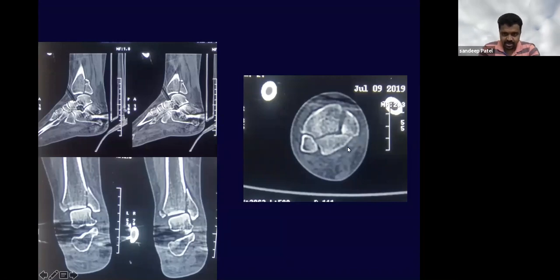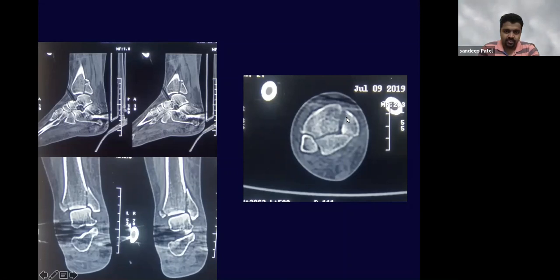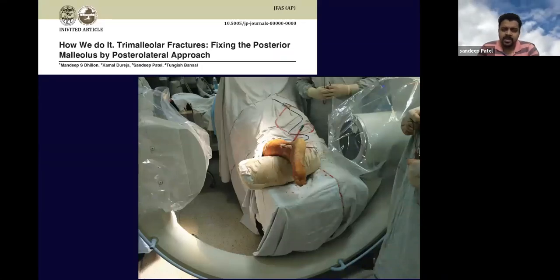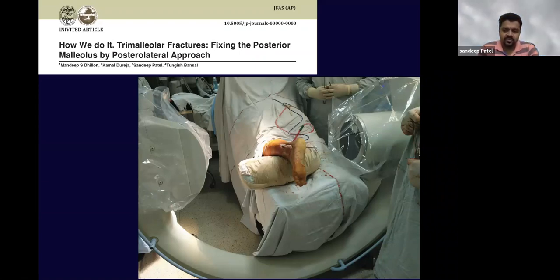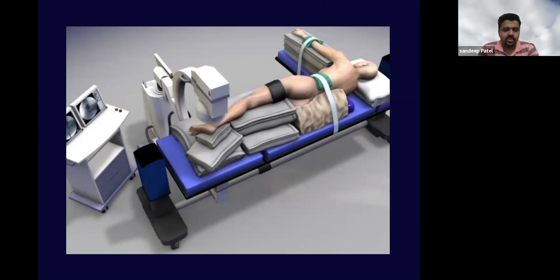We can see the posterior malleolar fracture and a medial malleolar fracture which is more like a vertical sort — actually a posterior medial variant. We have a publication about how to go across this. The positioning can be a prone approach, which we chose in this video recording, or a lateral position, which I also prefer. We will discuss in the Q&A when to choose which one.